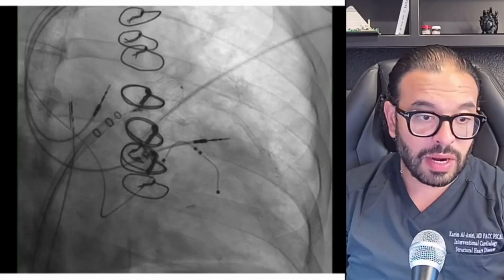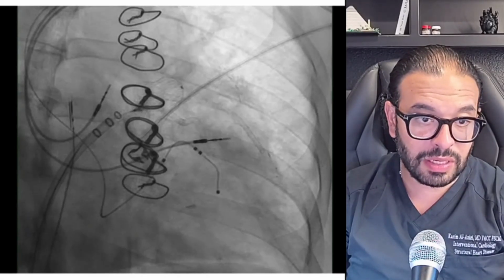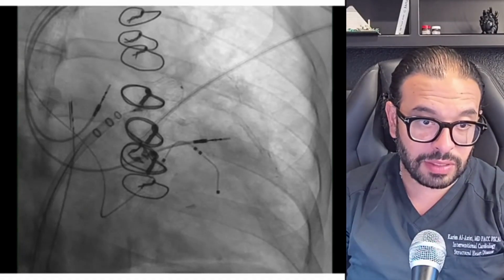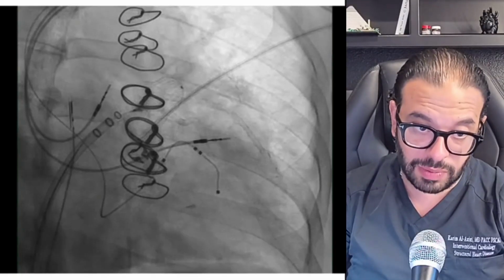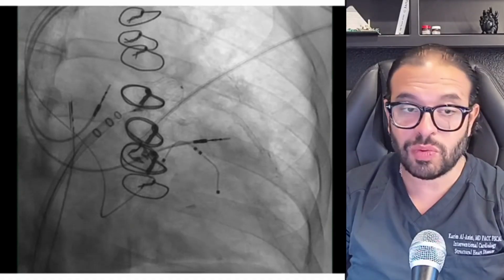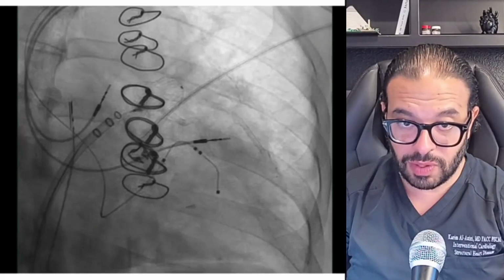If we look at our ICE imaging from the beginning, once we started releasing, the device forms very nicely within the appendage. You can see that it has a very nice waist where you can appreciate the compression of the device, suggesting that it should be stable. It is one of the important aspects of the pass criteria we would use to say if this device is sitting well and is ready to be released or not.